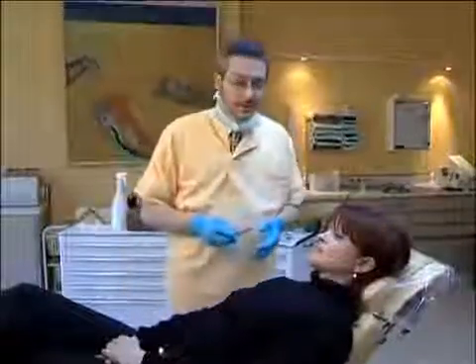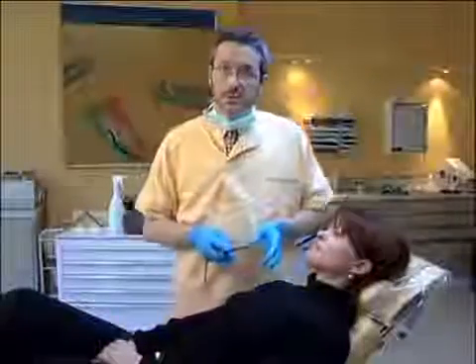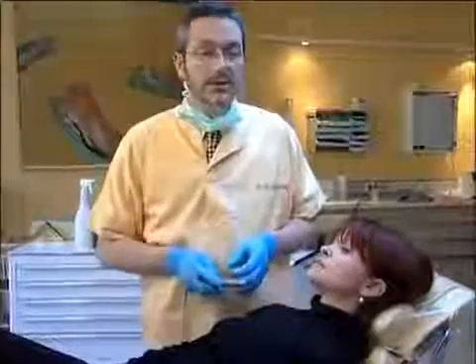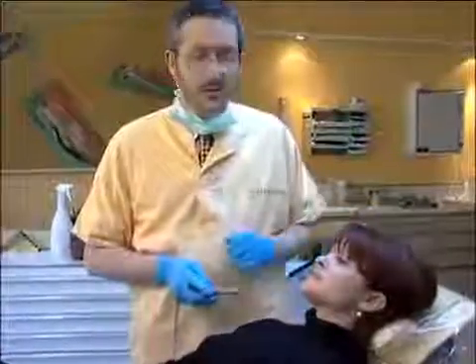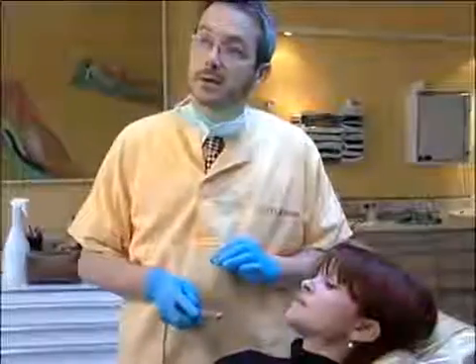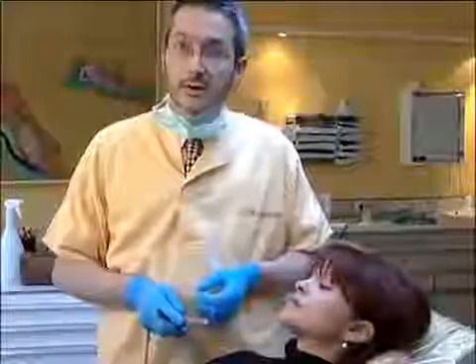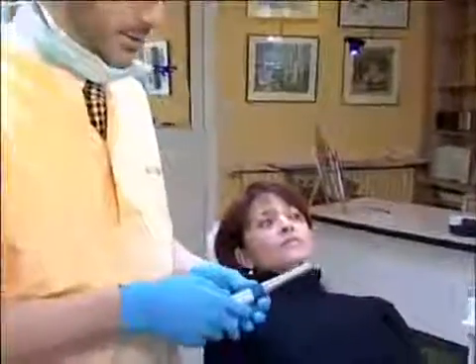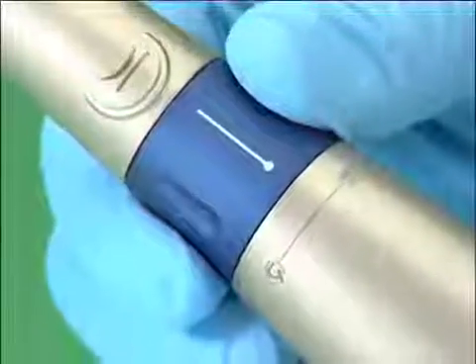We are going to complete the base tooth tint picture with general shots, i.e. facial shots and global tooth shots, allowing for better communication with the prosthesis lab. The camera is then placed on the extra-oral setting ring and pictures are taken.